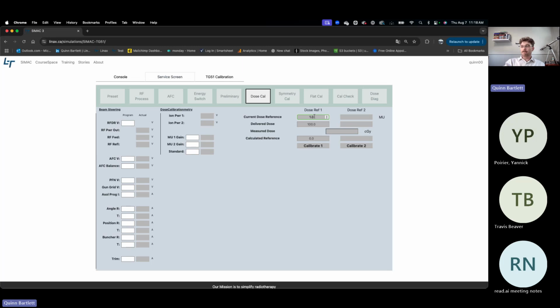So from our feedback, we've heard that it is very, very accurate to doing a TG51 test, and we've had a lot of great feedback that they're putting all their students through this every semester. We haven't really had this going for a year yet, and we're just having some success in seeing that people are really understanding TG51, and it's making it easier for the programs and clinics to teach this QA testing.